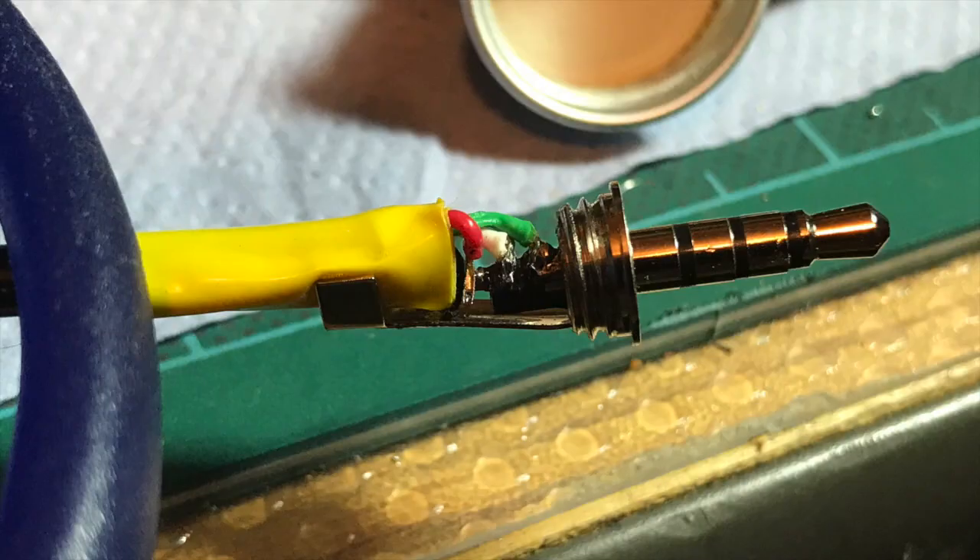The wiring for the 4-pin audio cable isn't straightforward. The green wire needs to go on the first point, the white wire on the second, the red wire on the third, and the black cable needs to be soldered to the shield.